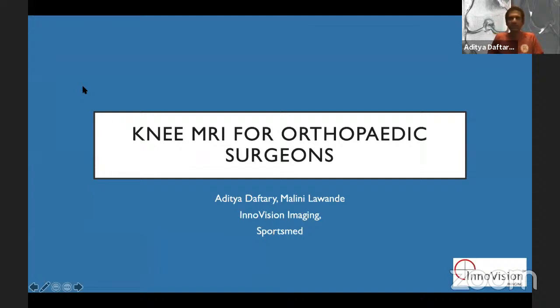I think the reason for the cartogram is to remember what the thing does. When we look at cartilage, we look at it in two ways, and we should discuss this separately. Essentially, if you're looking to see if there are cartilage defects, holes in the cartilage, punched out holes, or diffuse cartilage wear, then you do not need a cartogram. The time that you need a cartogram, or it becomes of any use, is if you have done a cartilage filling surgery, a cartilage repair surgery of some sort, and then you want to know what is the character of what is filling that defect.